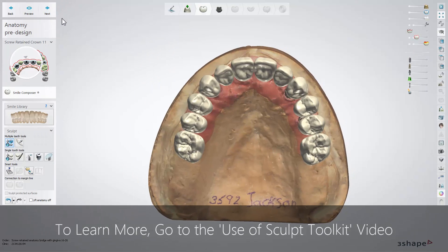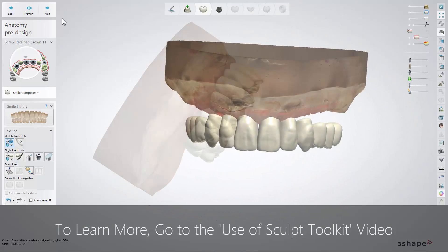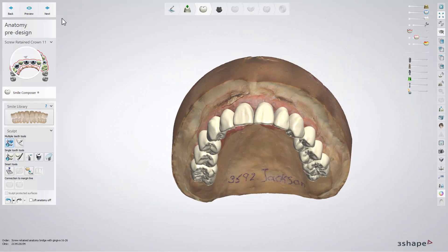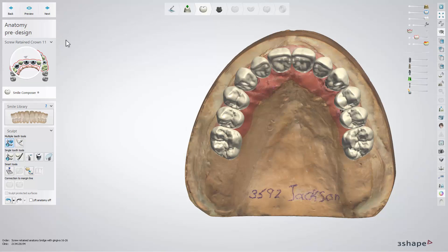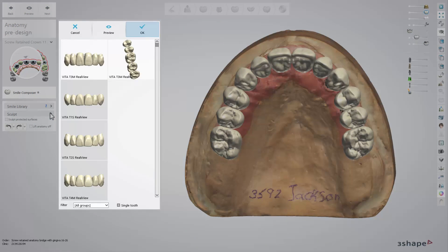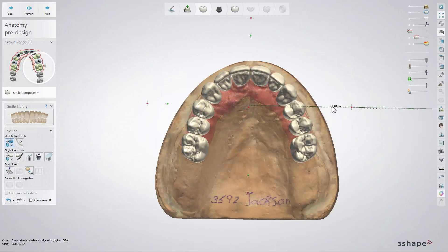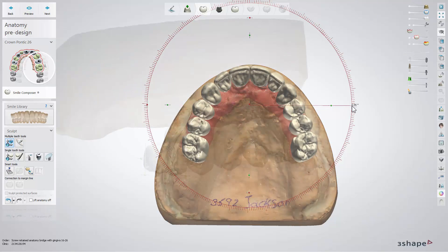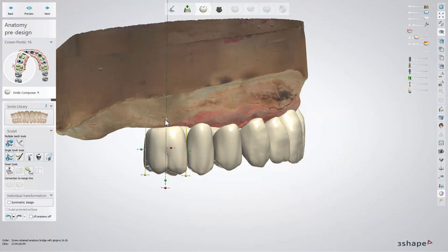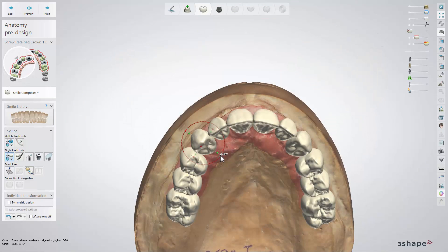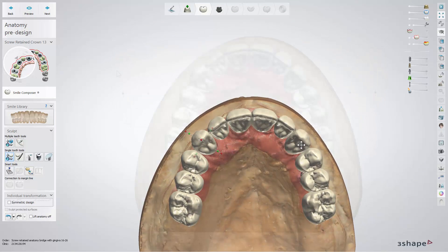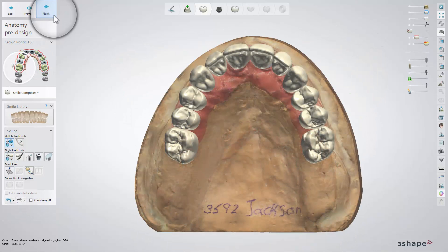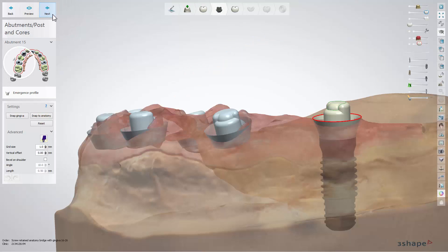In the anatomy pre-design step, the software will generate an initial suggestion for teeth placement. The Smile Composer's Smile Library allows you to change teeth anatomy, and the Sculpt tool gives you the possibility to change the placement in relation to jaw anatomy, the teeth in the arch, and antagonists if available. Having the teeth positioned, click next to move to the abutments step.